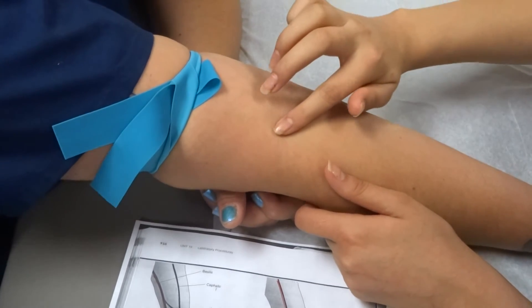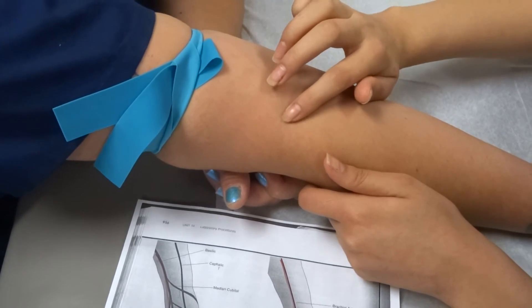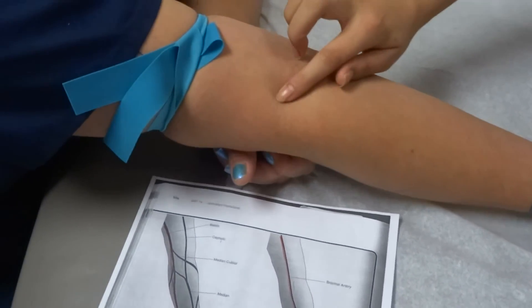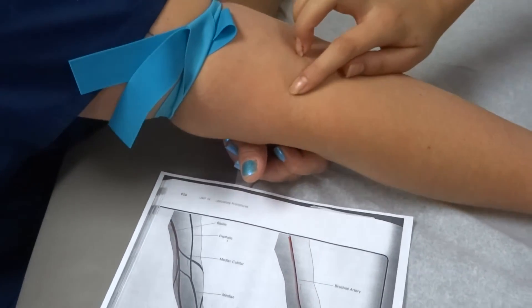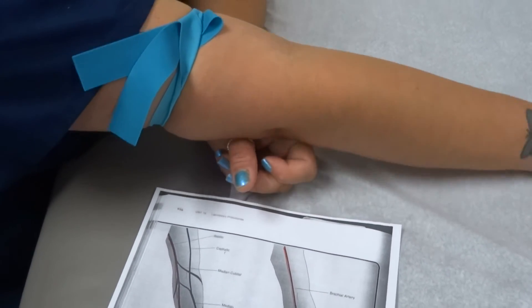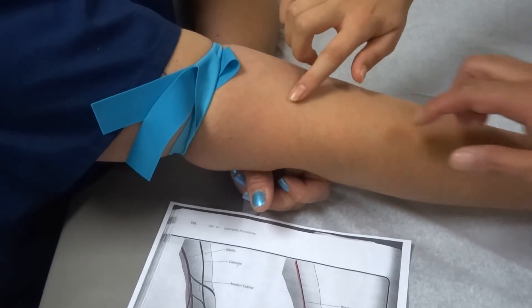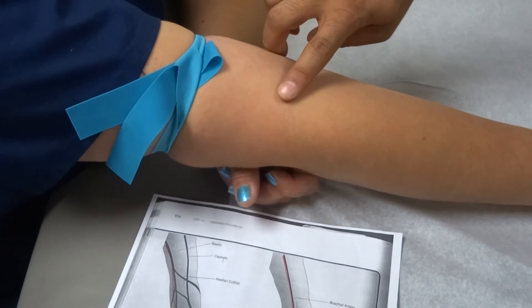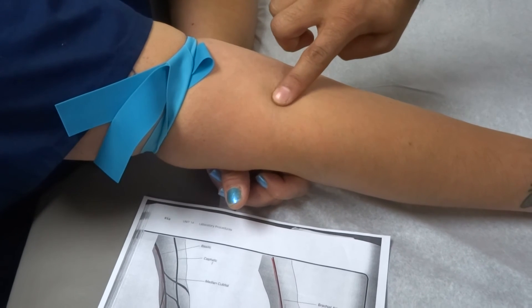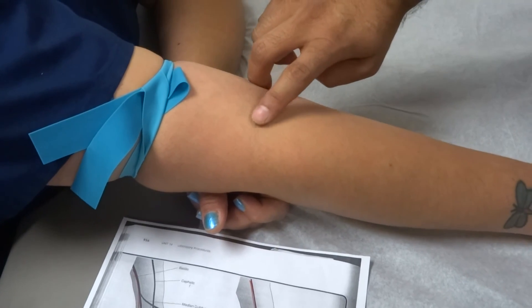I love having all these volunteers. Ask her — I used to hate it in the beginning, I was so scared and nervous. I'm going to have Evelyn stand next to me so she can rub off on me. Put a tourniquet on this one first — this is the one that everyone has. My veins retreated, they're in there hiding. I think that's a tendon. You don't feel it? You feel it now? Yeah.